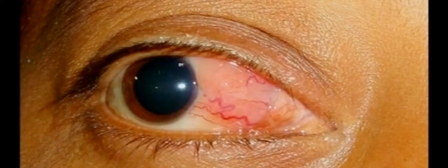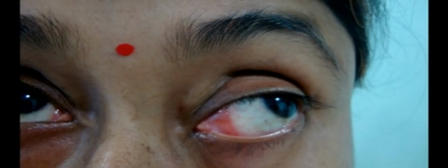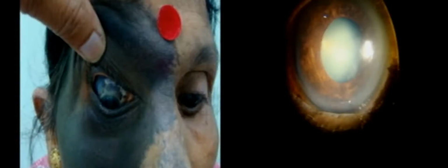Again, this is a salmon patch appearance, and the same lymphomatous cells, which are CD20 positive, CD3 negative, so it's a B-cell lymphoma. Now again, a milder, smaller one, where an incisional biopsy was taken, showed lymphomatous cells with CD20 positive.